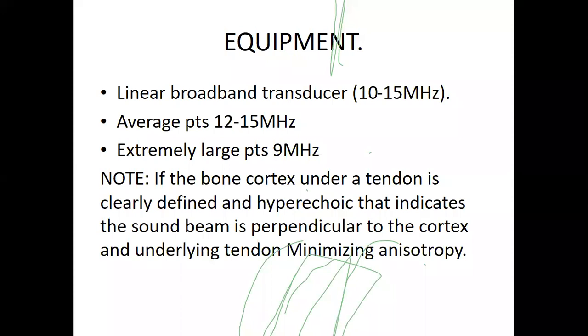Before I continue, I should also mention that with shoulder joints, sometimes we tend to be scared to scan simply because we may not understand, we may not orient ourselves, we may have some knowledge gaps, or maybe even lack the skill or the technique on how to go about it. But I can assure you that a shoulder ultrasound, if you know exactly what you are looking for, can take 10 to 15 minutes maximum.